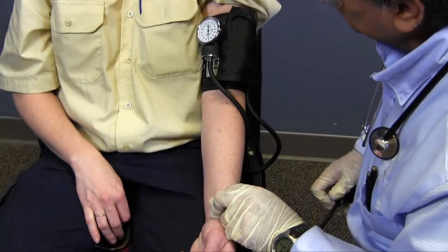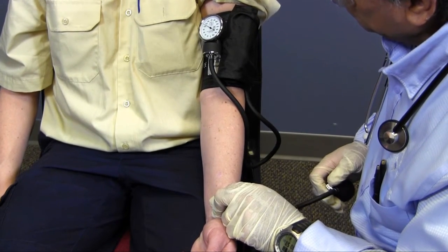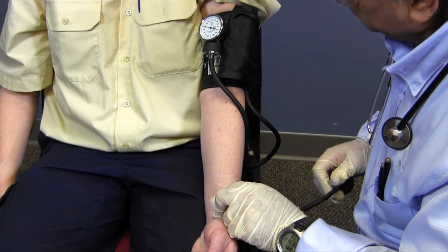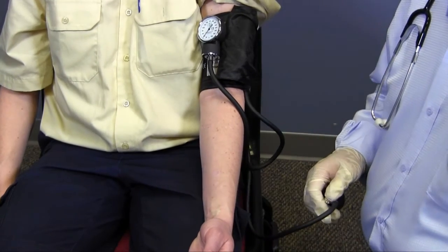Another method of determining blood pressure is by palpation. To do this, I once again apply the properly sized blood pressure cuff above the arterial point. I locate and palpate the arterial point distal to the cuff. I inflate the cuff until the pulse is lost. I slowly release the air until the pulse returns, at which point I can identify the systolic pressure. I then record the results.